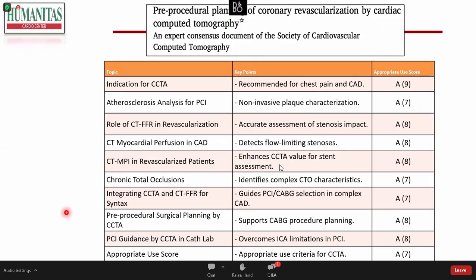Finally, coming to a little more advanced topic that I think is of great interest. I told you that cardiac CT is really the new tool for stable chest pain. We can look at plaque imaging, we can look at the degree of stenosis, we move to perfusion and FFR, fractional flow reserve, to look at ischemic heart disease. And I think the new frontier, like we do for TAVI planning, like we do for endoprosthesis, like we do in any other field, is to use CT for prediction of coronary revascularization and pre-procedural planning.